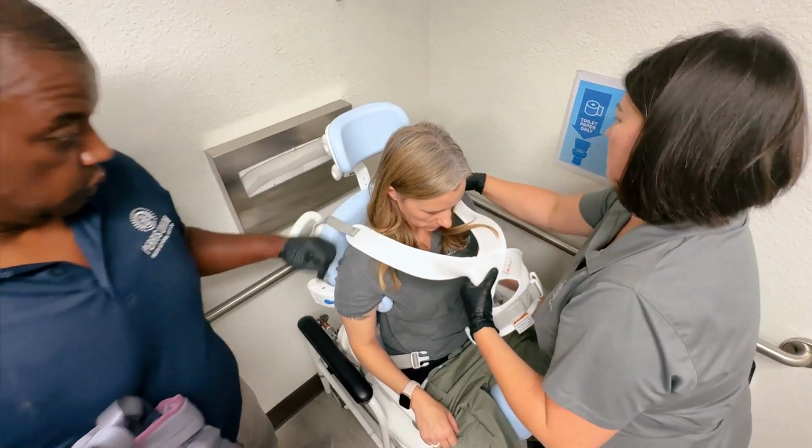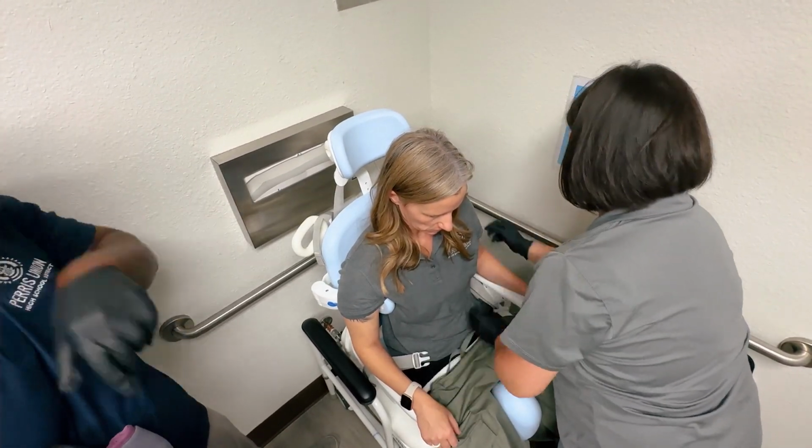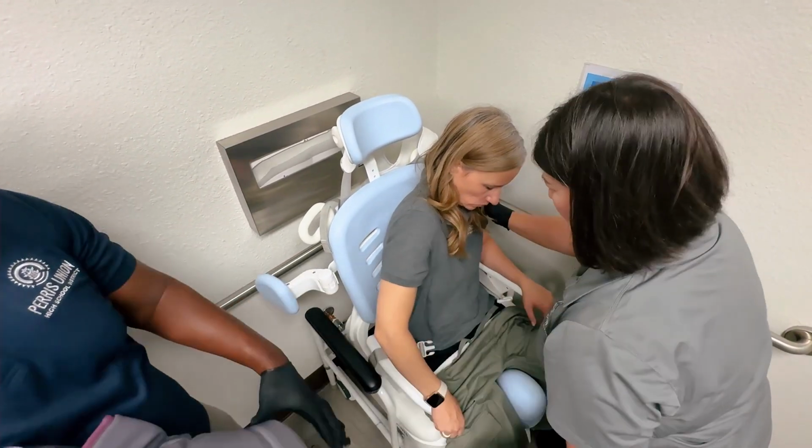With one assistant in front of the student and the other assistant to the back and side of the student for support, remove adaptive seat fasteners and reposition the toileting sling around the student.